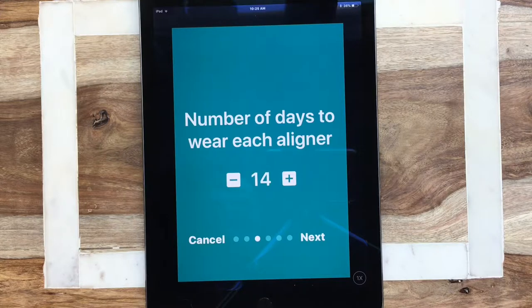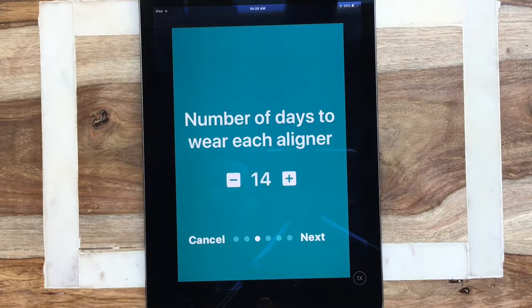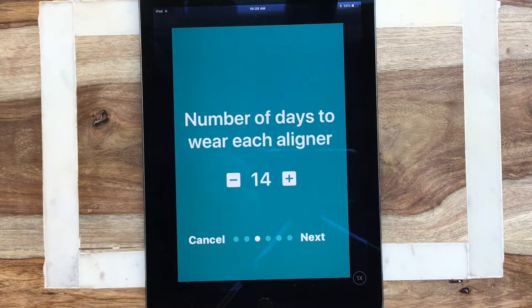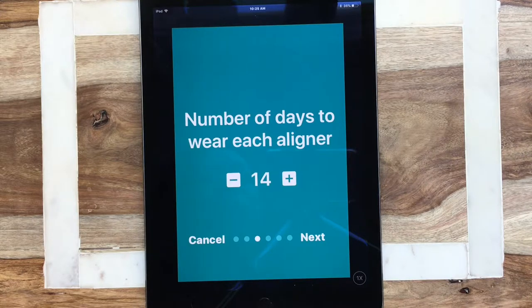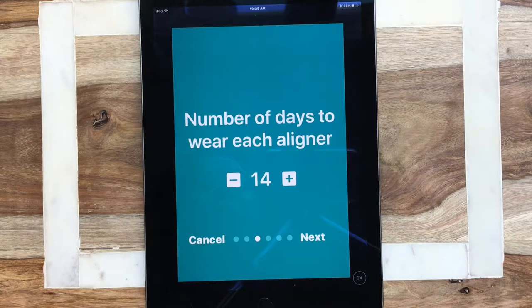Next is the number of days to wear each aligner. Typically most orthodontists will have you start at 14 days, which is two weeks. However, for my own patients with good compliance I'll usually bump them down to about 10 days, or even for my teen patients five to seven days. Just to keep it simple, we'll set it at 14.